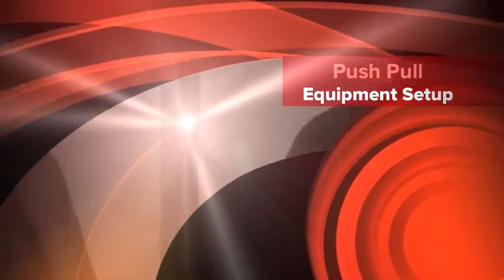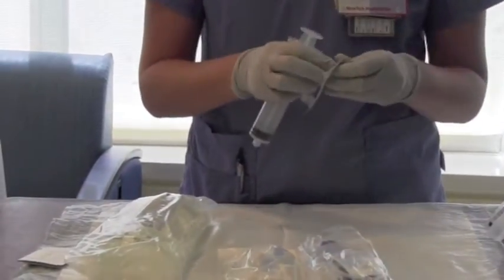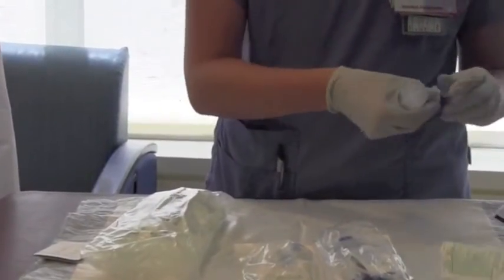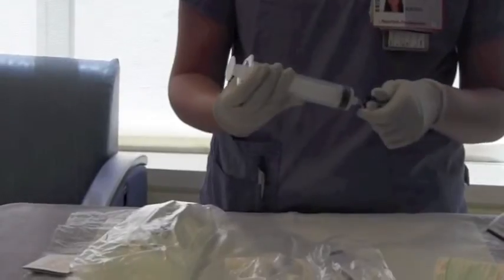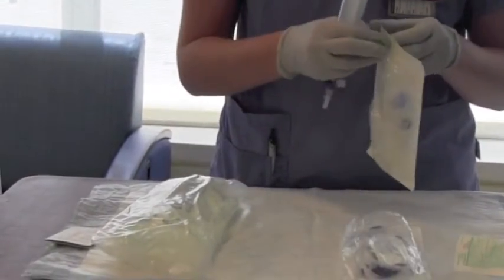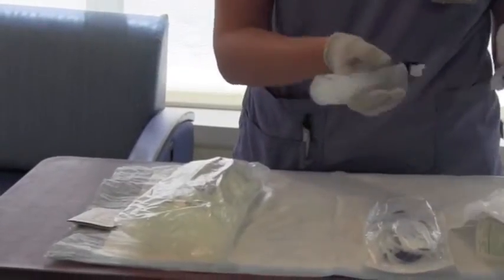So now what we're going to do is set up the push-pull. So you're going to need a 60 cc syringe, and you'll attach that to a stopcock. And then you're going to need an extension set to go on the other end of the stopcock.